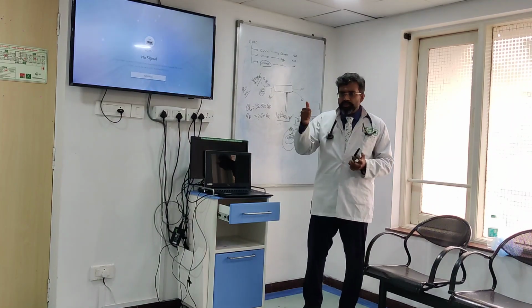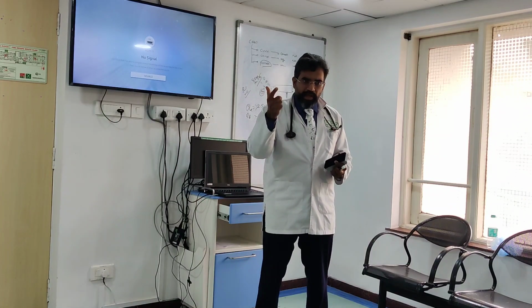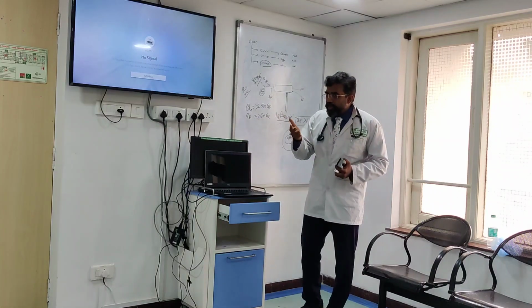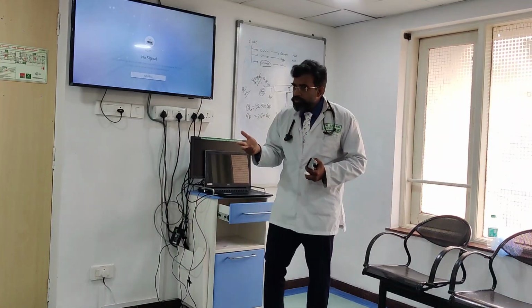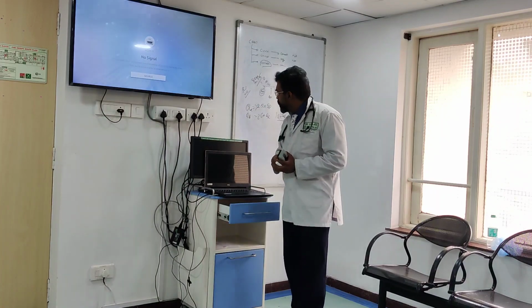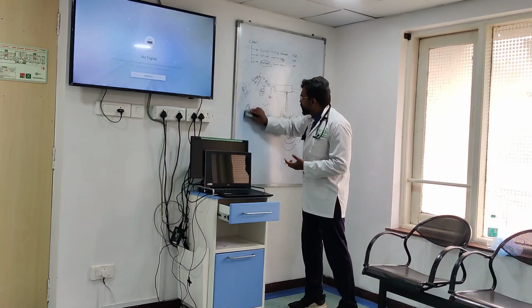Right? You've understood what is effluent. You've understood what is dose. You've understood how to calculate the dose. You've understood how to maintain your blood pump, at what speed to keep it, so that you ensure that the filter does not clot. You've understood these things? Now let us go about all this filtration business, this problem that is occurring. Okay, so how do you calculate this?